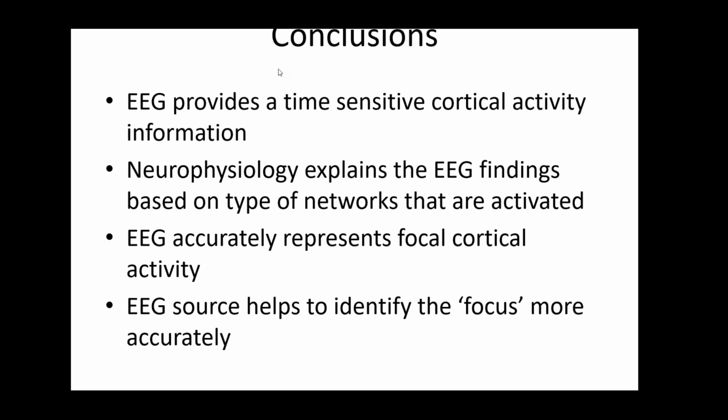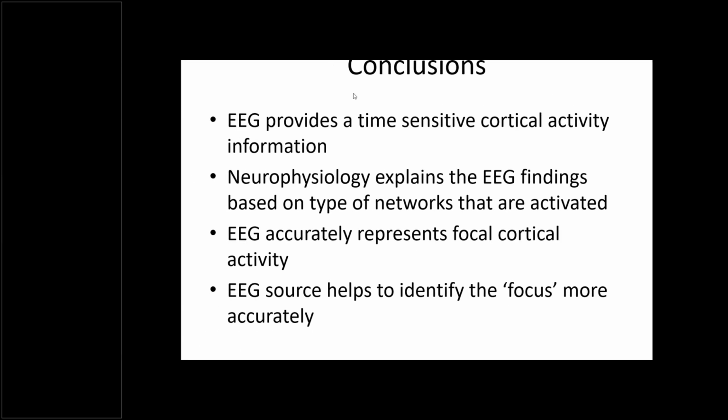If you get to measure, let's say, a frequency, usually with quantitative EEG, you can measure the spectra of an area of the brain, and you potentially do biofeedback, ask the patient to improve the synchronization of that area by relaxation, and you can see how this area synchronizes better. So you could use this technique to help them improve the attention. But yeah, it's a really interesting topic.